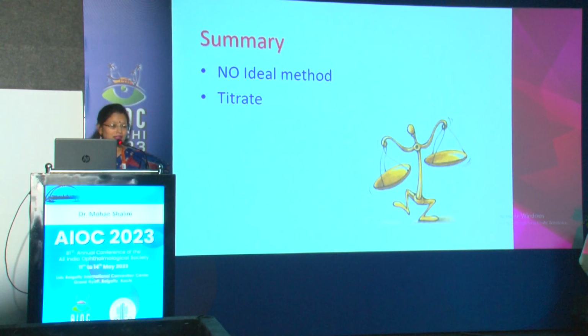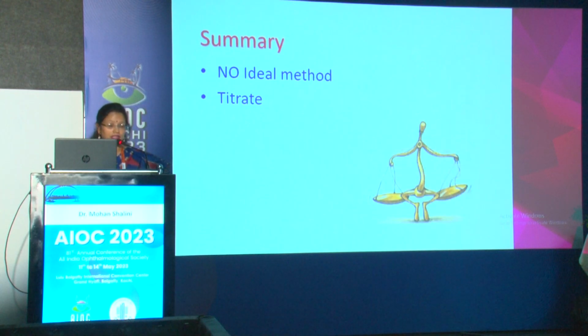So the summary is that there is no ideal method. We need to titrate for children, and it is always better to do it under general anesthesia, do retinoscopy, find the IOL power, and then implant the IOL.